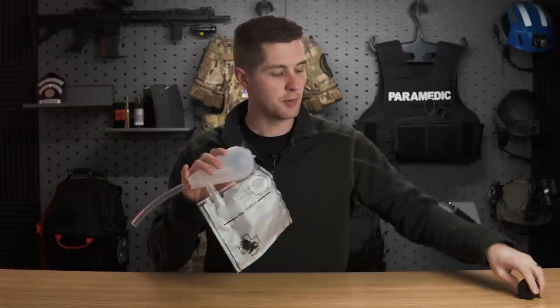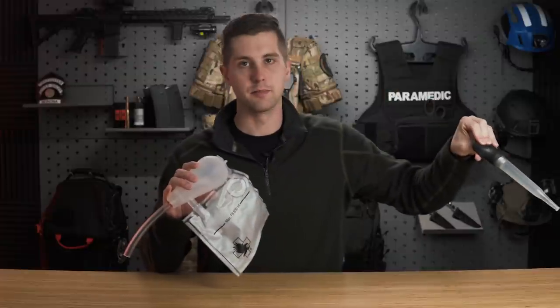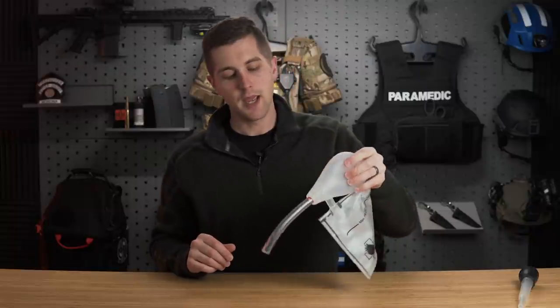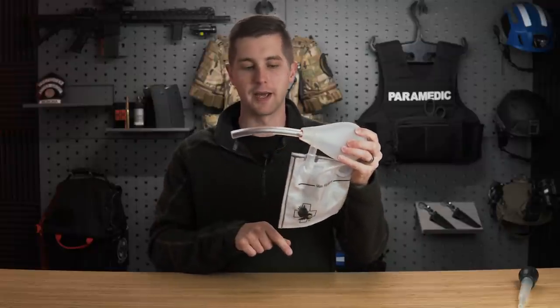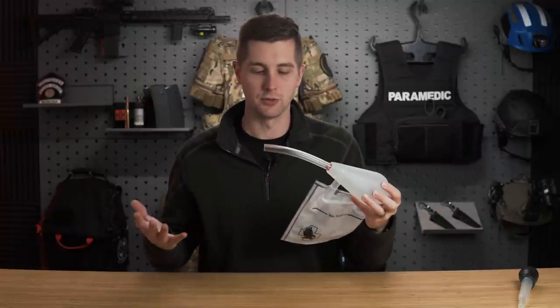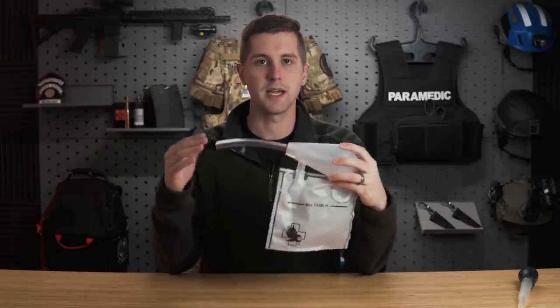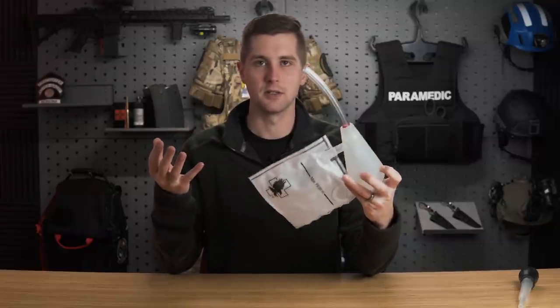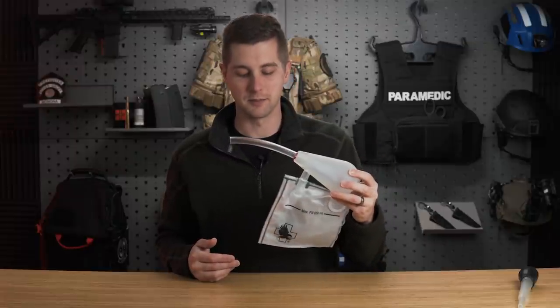As we suction — as opposed to the turkey baster where I put it in the patient's mouth, suck out, put it somewhere else, and repeat — this allows you to do continuous suction. As you squeeze it, it sucks into the bulb, and then as you let it out, a one-way valve pushes it into the bag instead of back into the patient's mouth. It works relatively well. However, when somebody has a lot of secretions or really chunky vomit — something you encounter a lot in EMS — these start to fail pretty quickly and are just a stop gap until you can get them something else.